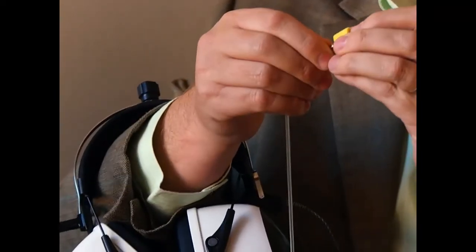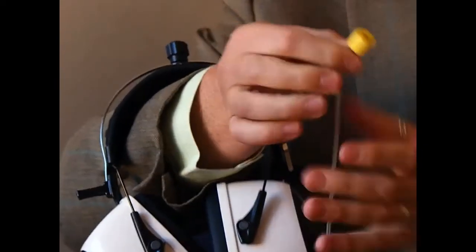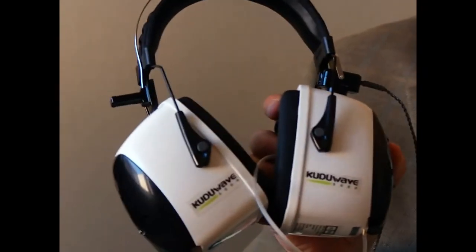So you will typically put a little foam ear tip on this tube, like that. There's a little hole going through the ear foam. You roll it up and you will put it into a patient's ear. So it will be the ear tip plus the headset that covers the ear.